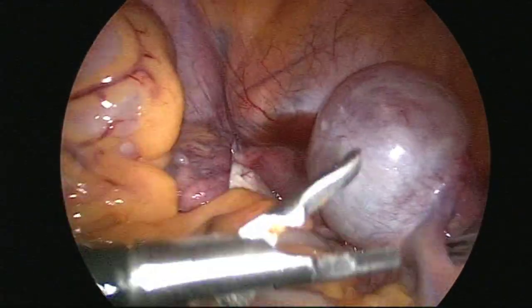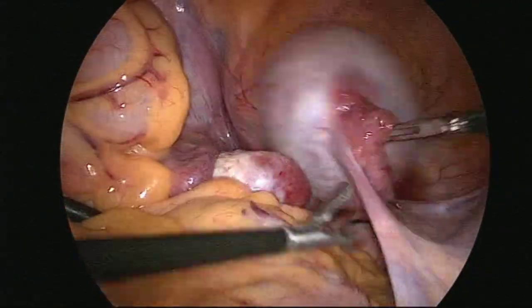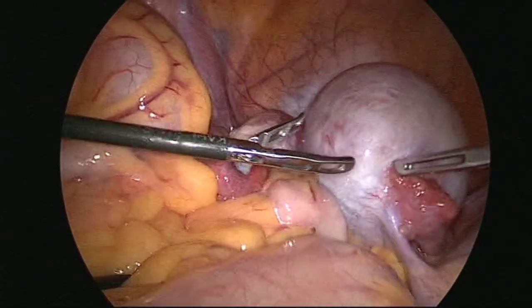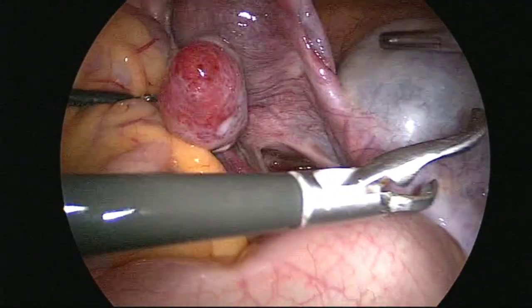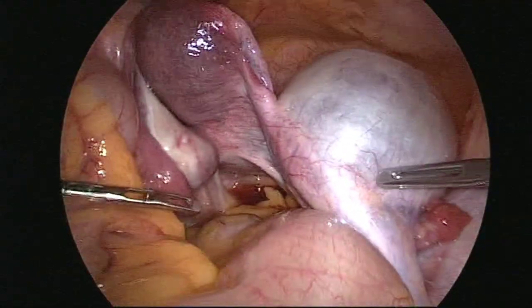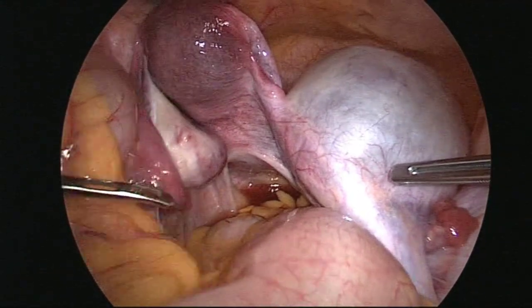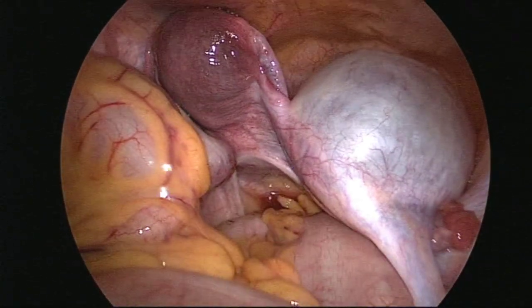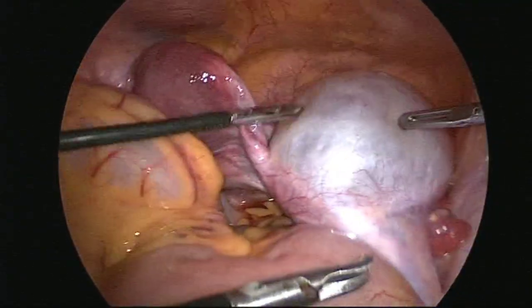Hello everybody. Today we are going to operate a case of simple right ovarian cyst. This is a case of primary infertility, and you can see there is a big cyst on the right side of the ovary, and you can also see that the bowel is not prepared at all.